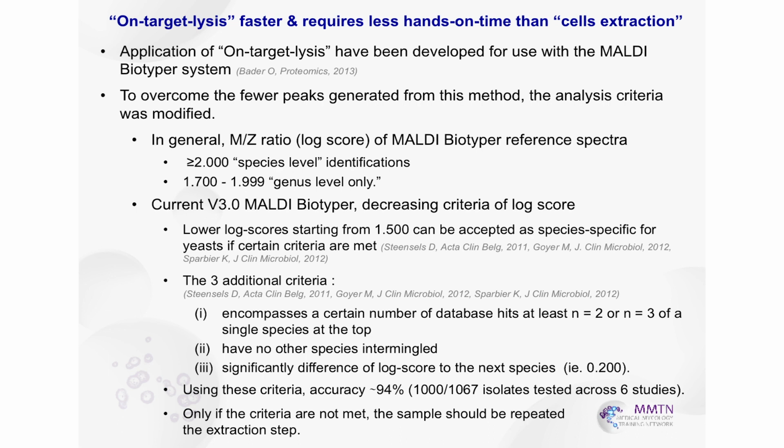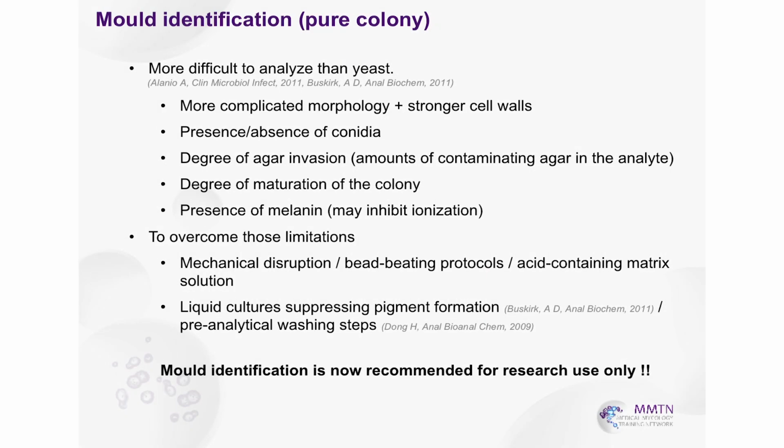So you have to be back. Don't only stay in the advanced. We all have to be in the real world. Sequencing is the best, in my idea. Mold is more difficult to analyze than yeast for identification.